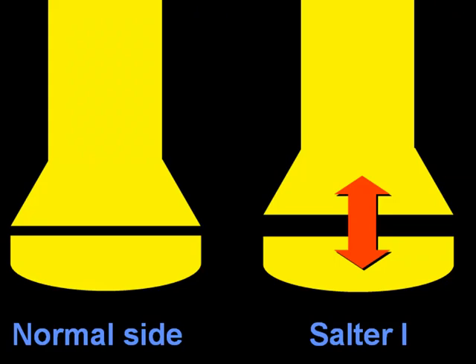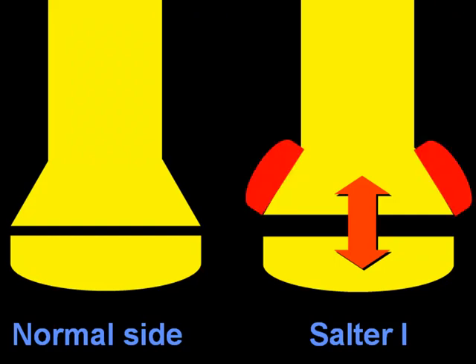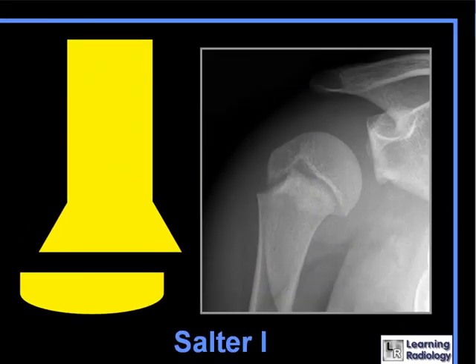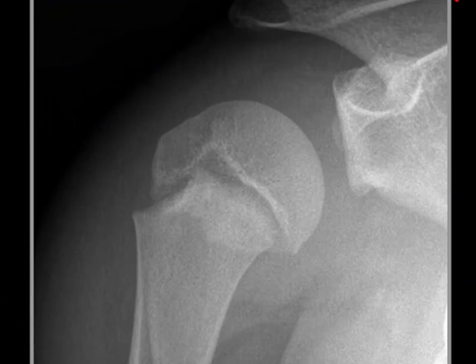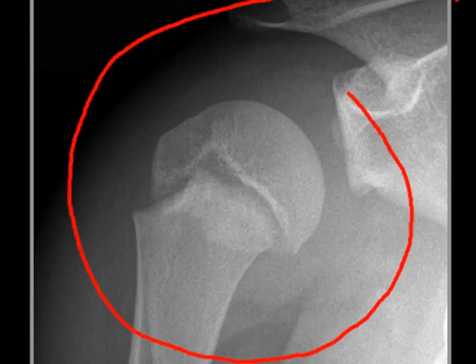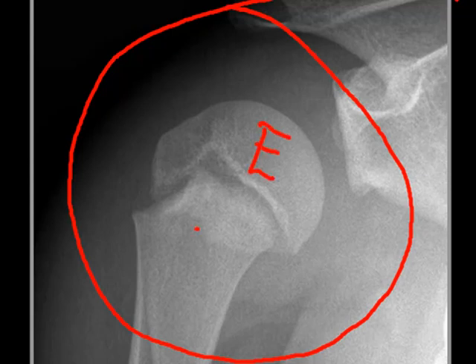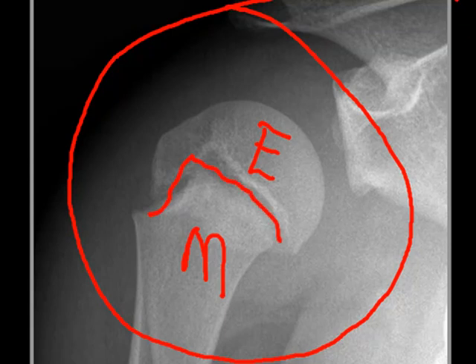Sometimes, after a matter of several days of immobilization, periosteal new bone formation can present itself and indicate the presence of a fracture. Here is an example of a Salter-1 fracture of the proximal humerus. You can see that there is displacement of the epiphysis on the metaphysis and widening of the epiphyseal plate.